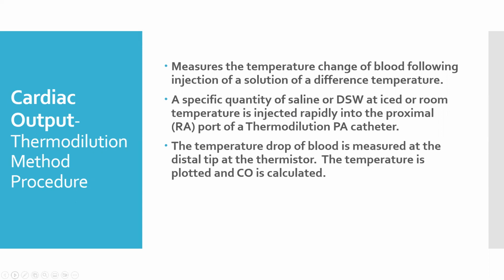20, 25 years ago, you walked into most any ICU, in other words, not a cardiac ICU, they had a Swan in place. Now, they're pretty commonplace in cardiac ICUs, and post-open heart units, that sort of thing. But they're not commonly used elsewhere because we now have other methodology to measure and estimate things like cardiac output that are much less invasive, that can even do some of this off of an A line, meaning what we do with that information from the A line is much more sophisticated than 20 years ago, all right?